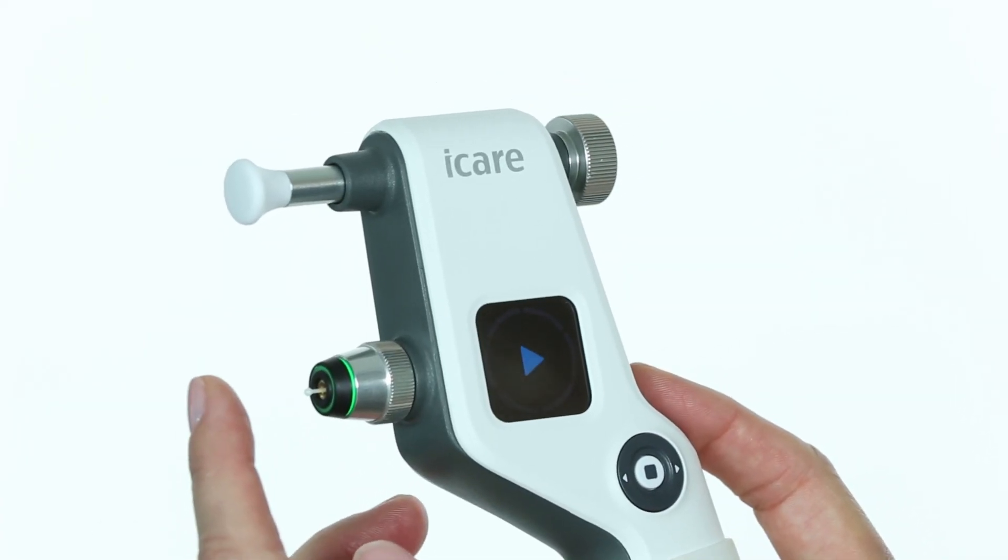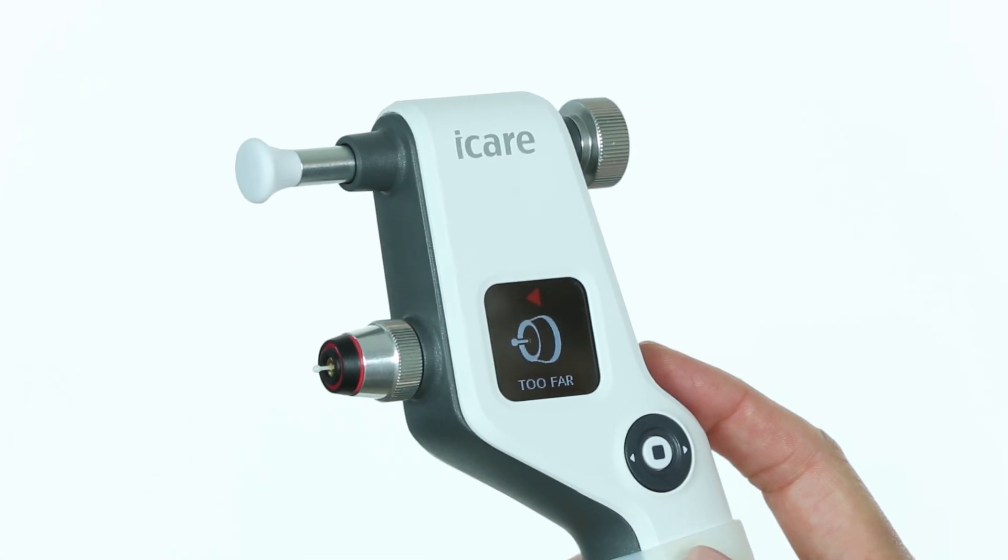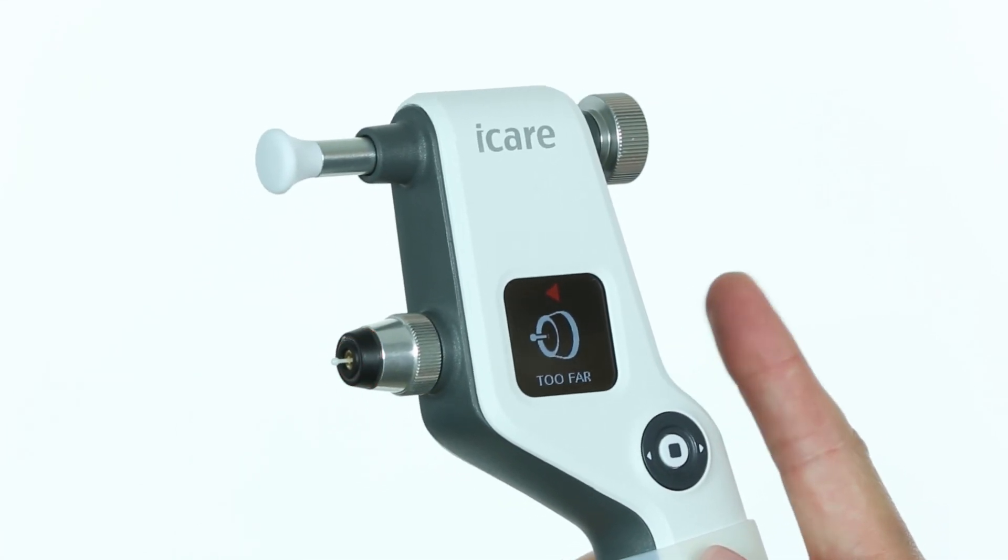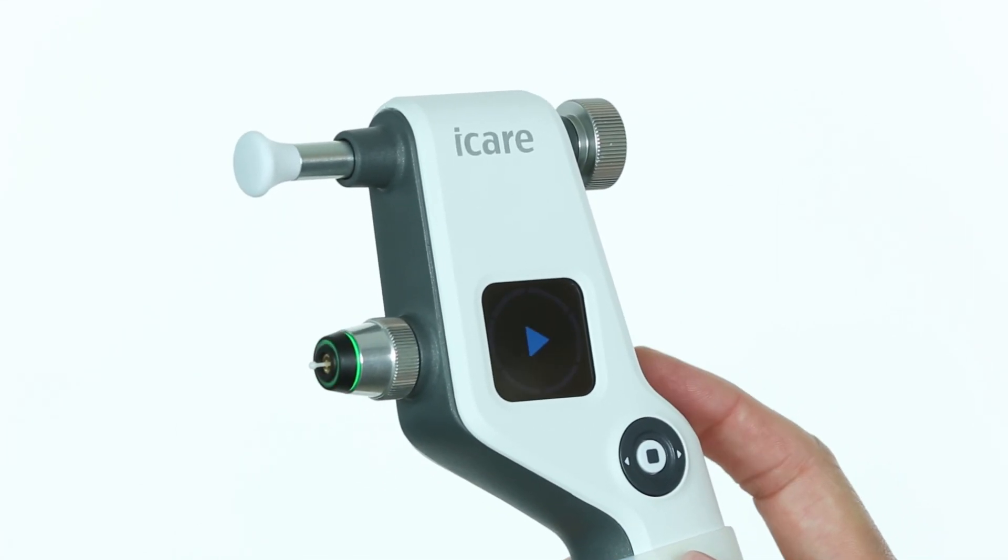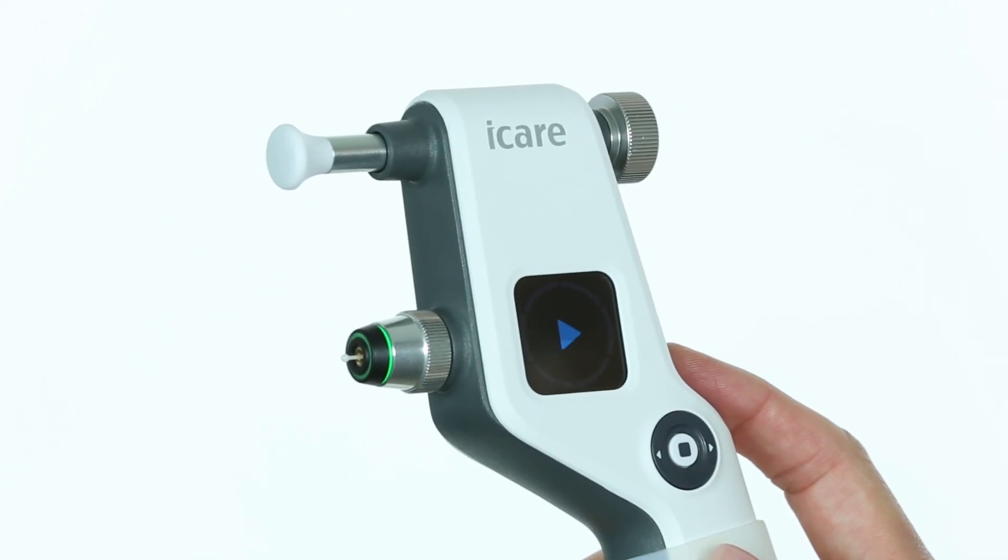If you are too far from the cornea, then too far will show in the display, and the probe base light flashes red. Clear the error message, correct alignment, and continue measurement.